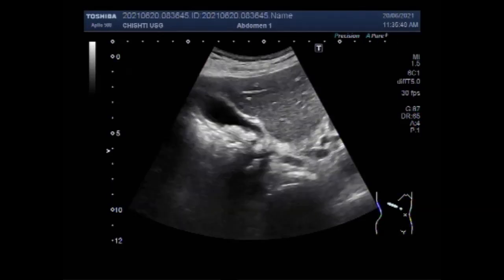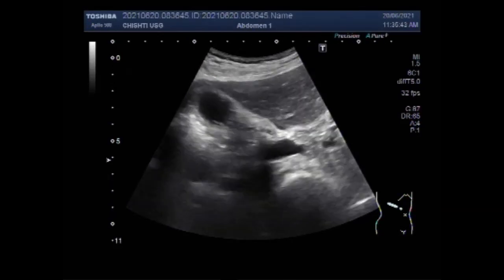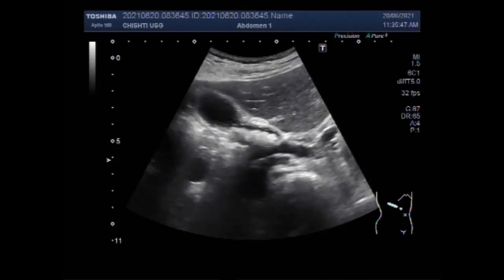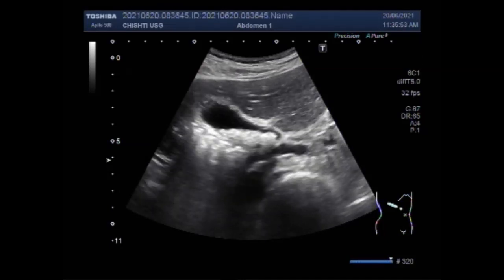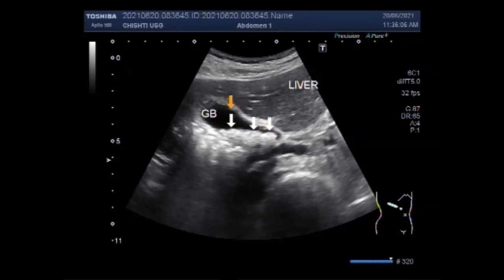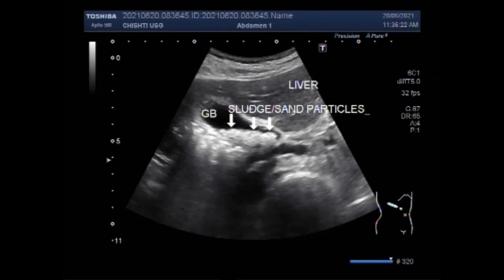You can see the significant amount of thick sludge in the neck and body of the gallbladder. The colon will have haustra, which differentiates it from the small bowel — you can see the haustra in the long-axis view. The presence of inflammatory fluid around the appendicular area is an important sign.